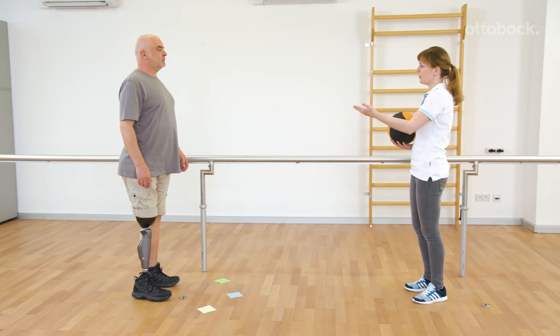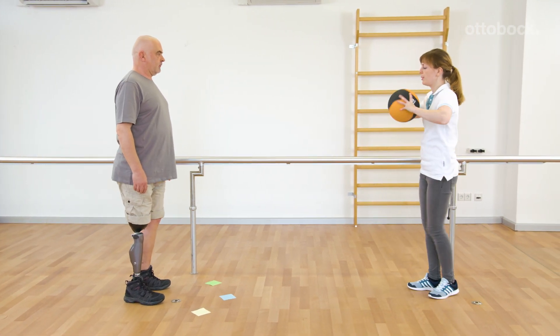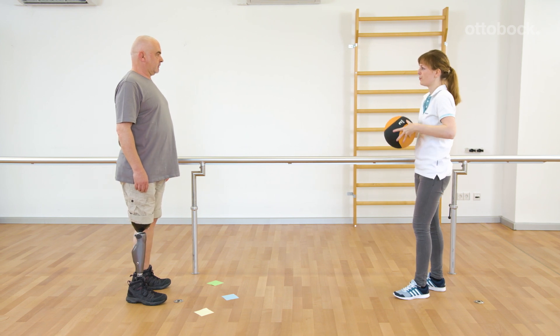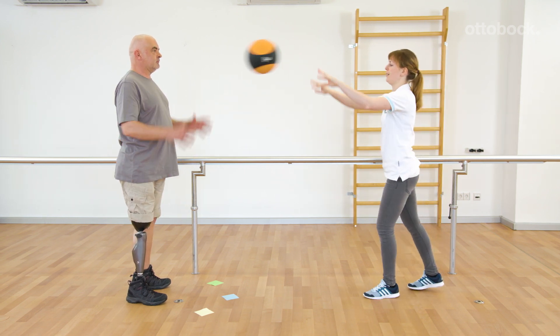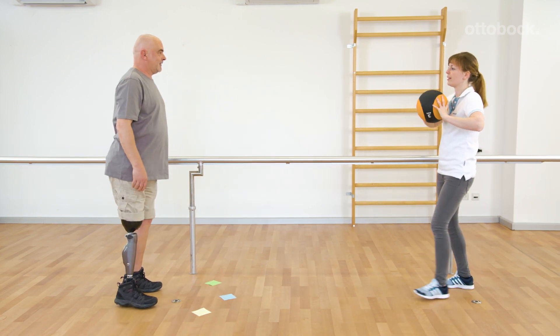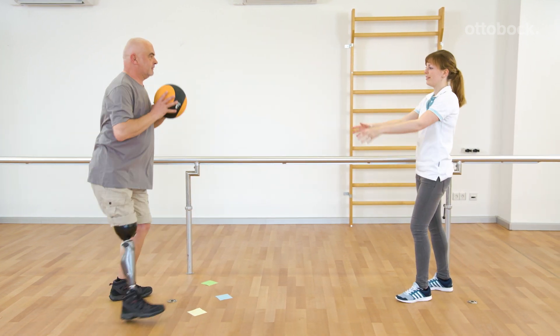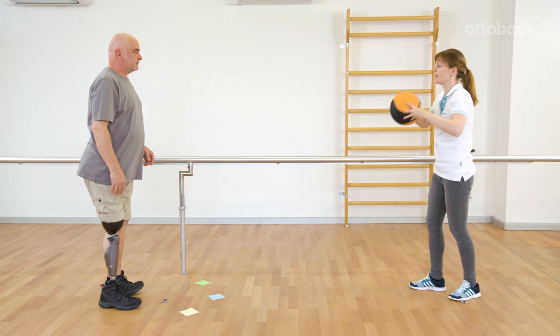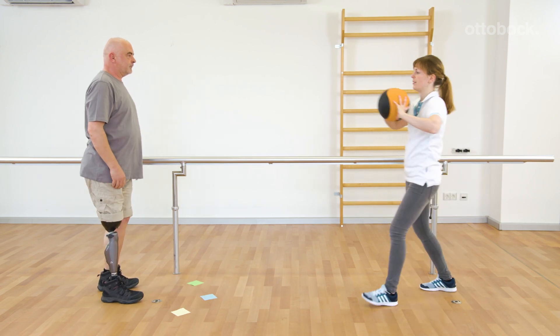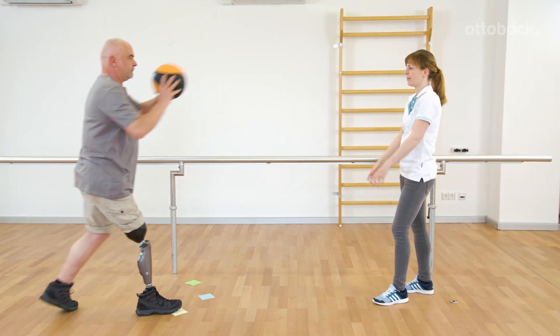Franziska decides to use a medicine ball to further improve Gerhard's training. At first, Gerhard should use the yielding technique only when throwing the ball. Later, he should also use it when catching it if necessary. The aim is to intuitively use the resistance to absorb movements and to avoid a high impact to the hip joint. The movement should look smooth and dynamic.